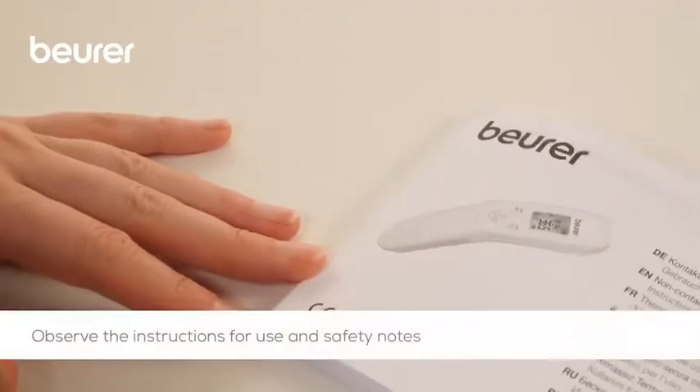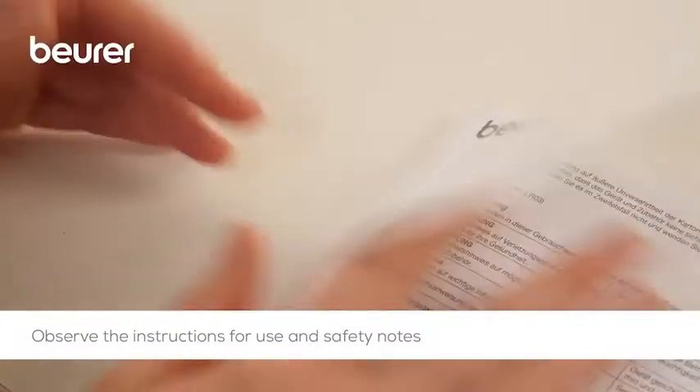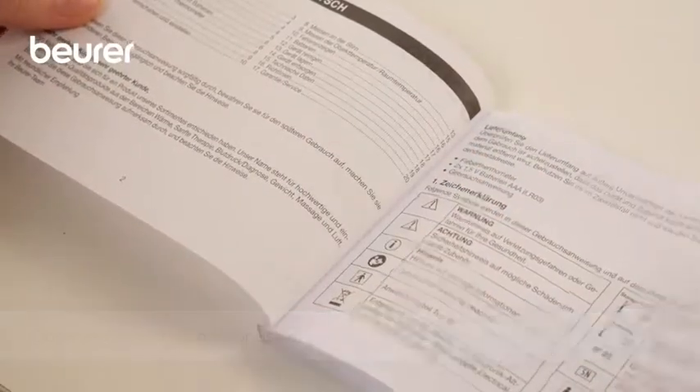Observe the instructions for use and safety notes. We hope you enjoy using your non-contact FT-85 clinical thermometer from Beurer. Stay healthy!